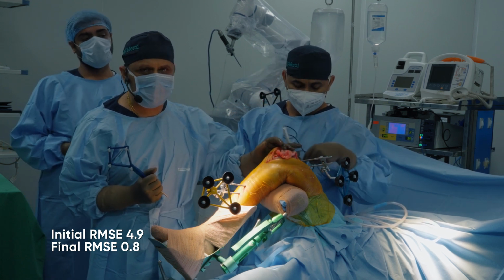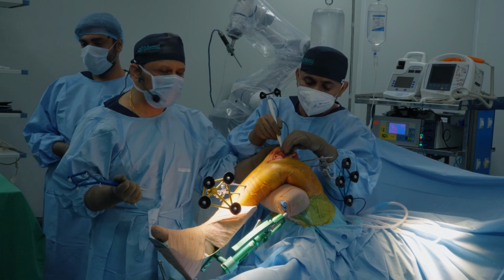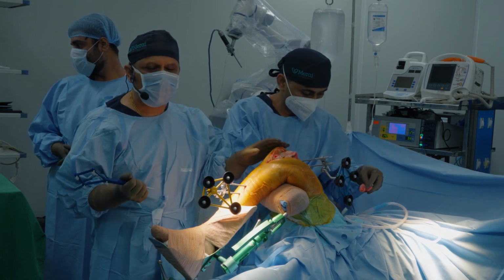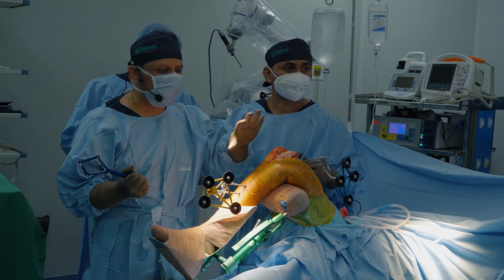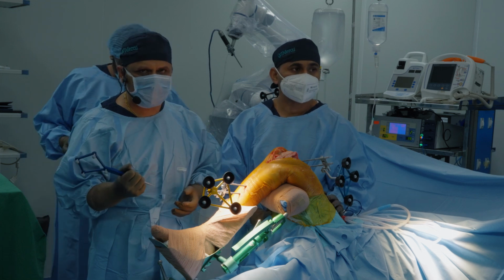These verification points, every system has different ways of verifying. Some have pins or buttons which are loaded on the femur and the tibia to verify. In this system, there is no extra metalware to touch, so that you can touch these points automatically. The other points are calibrated on the femur. Once we do the tibia, the same points will be taken for the tibia as well.